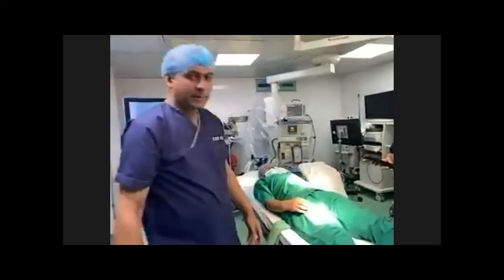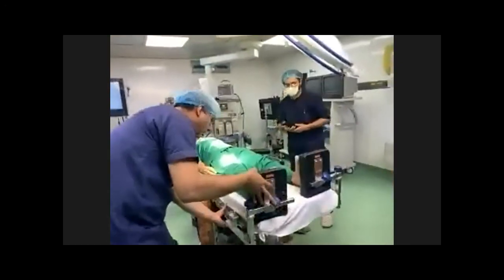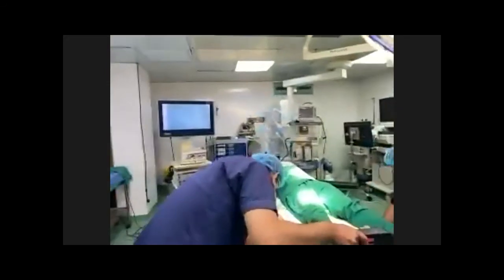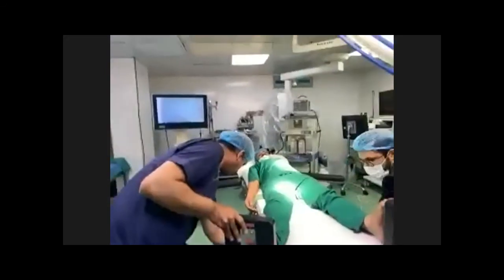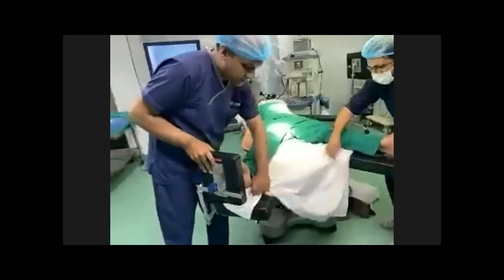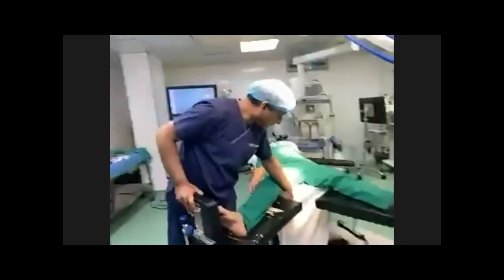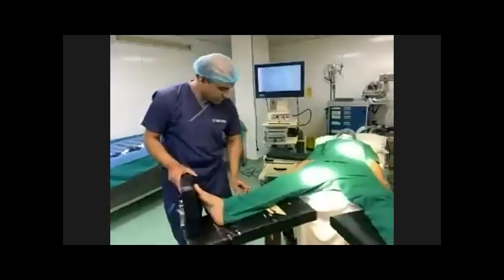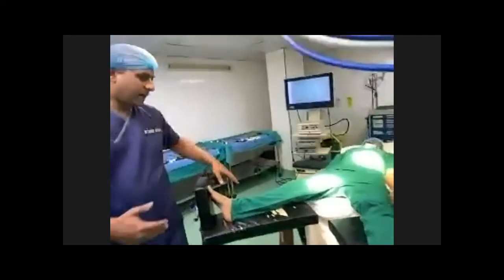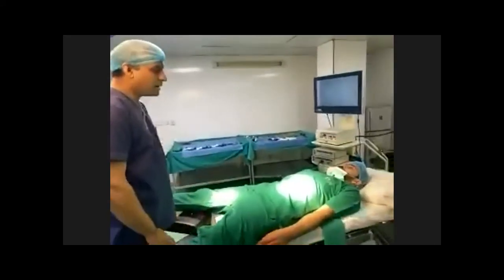Another important position is called the French position. There are two types of surgeons. Some surgeons want to do the surgery standing on the right or left of the patient, and there are surgeons who want to perform surgery standing between the legs. If the surgeon is standing between the legs, this is called the French position.